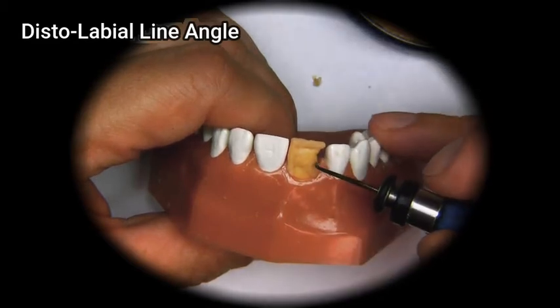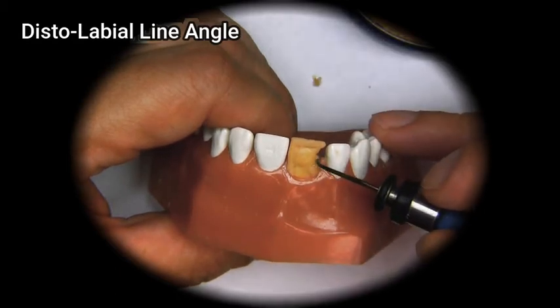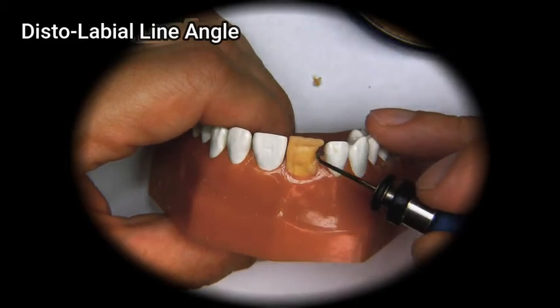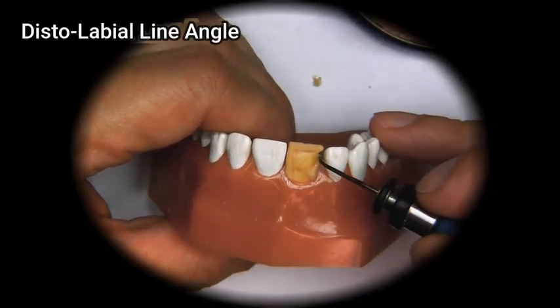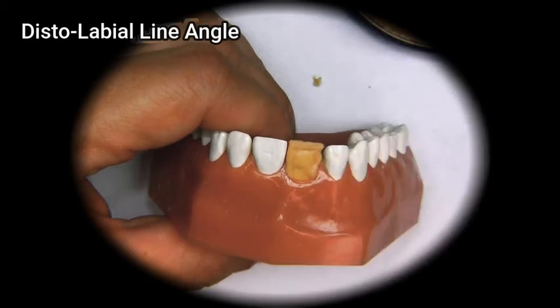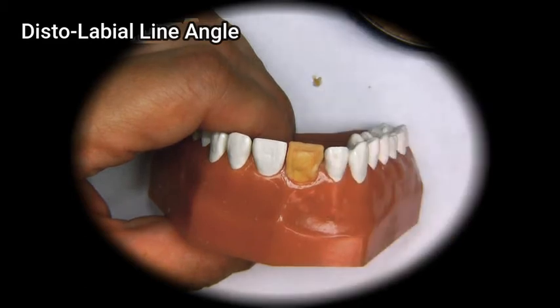So we come up, make sure you control that heat, and kind of build it out slowly. Go a little bit wider as you're getting closer and closer to the incisal edge.